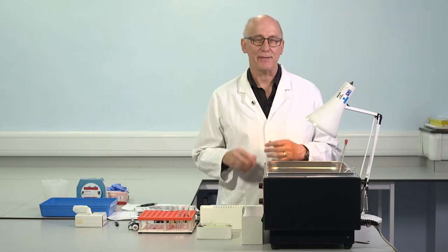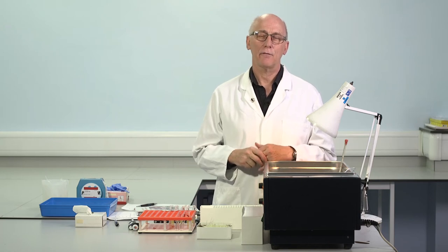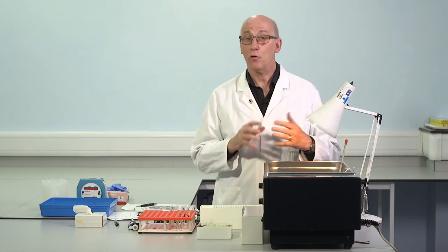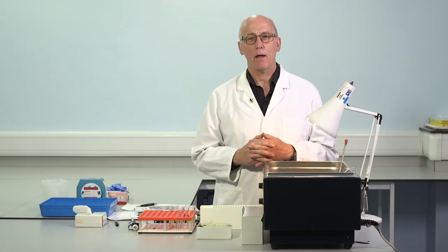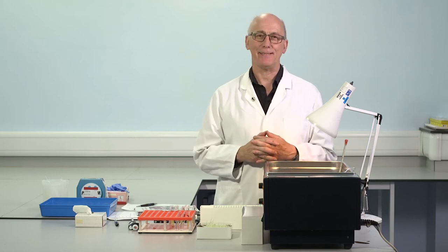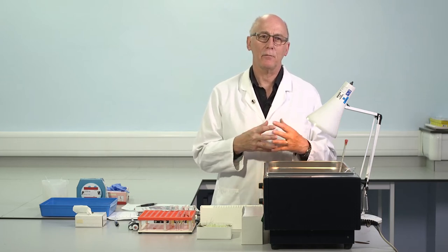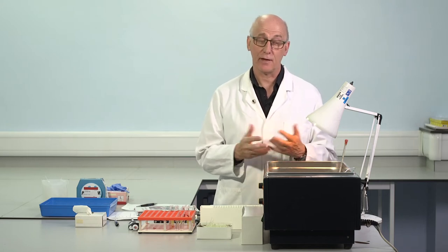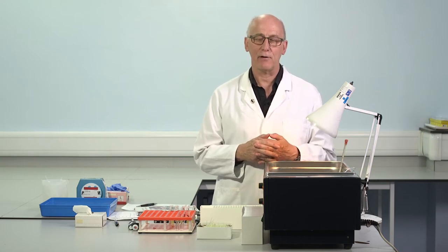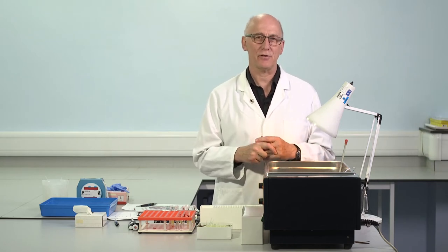We'll be doing some tests with two different APTT reagents, and these two reagents are different. They have different phospholipid concentrations, and we'll talk more about that in a moment as we begin the testing. They also have different activators, and there is a growing interest and focus on the activators present in APTT reagents, particularly as we're beginning to see increased use of extended half-life products, factor 8 and factor 9, in development and beginning to be used, and it's becoming clear that the activator in APTT reagent can have an important influence on the results which we obtain, particularly when we use that reagent in a factor 8 assay.